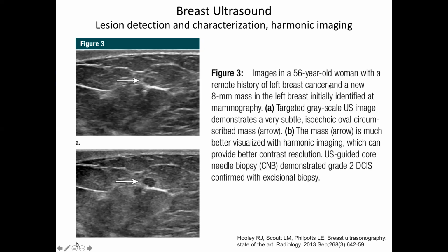It doesn't say which harmonic, it just says harmonic. So it could be the first harmonic, but it certainly makes a difference for the contrast to noise of this feature, right? And so again, this is just a button on your echo machine, and you can just try harmonic and see what comes out, right?